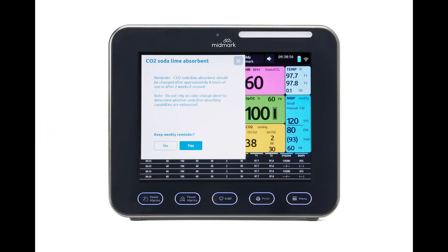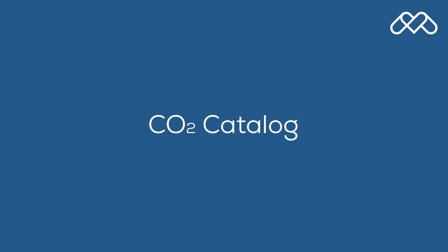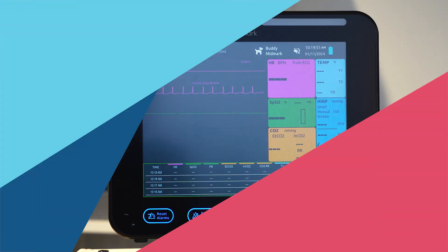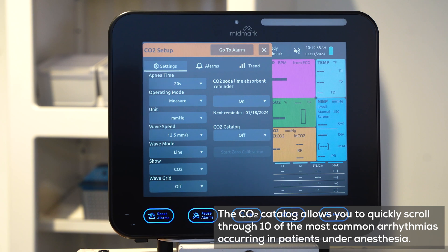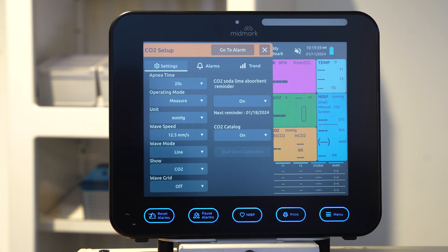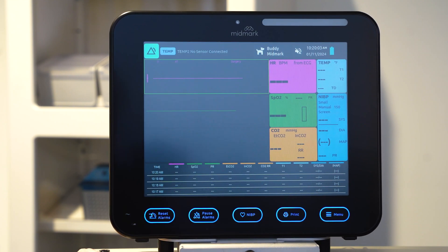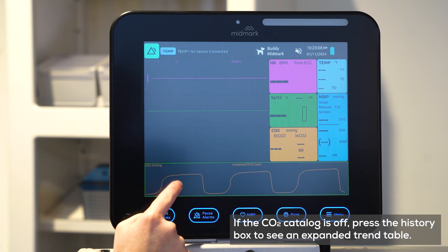Weekly, the CO2 soda lime absorbent reminder will display, providing best practice reminders on replacing CO2 absorbent. To turn on the CO2 catalog, press on the CO2 waveform, find CO2 catalog, and press on. To display the CO2 catalog, return to the main screen by pressing X in the upper right hand corner and select the NIBP history box.